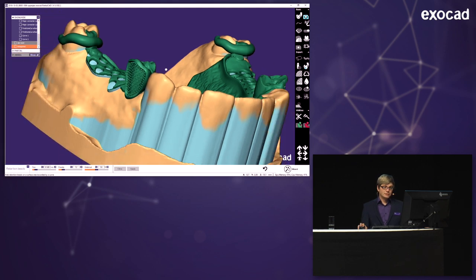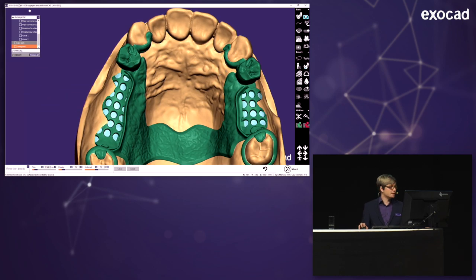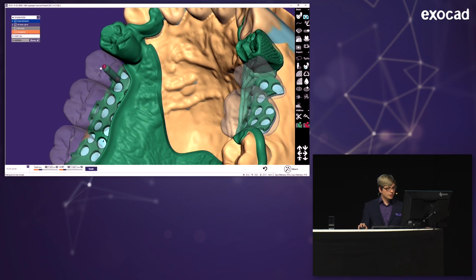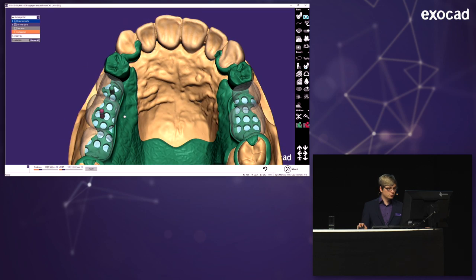And one thing you can do as well, while we're talking about retentions, is actually add retention posts for your acrylic teeth. So I can show all my imported parts again. And here there's an option just to add posts. I can click here. There it is. And I can just switch the length up a little bit and apply it. And I do the same for every tooth.